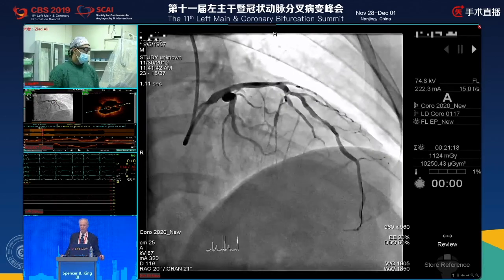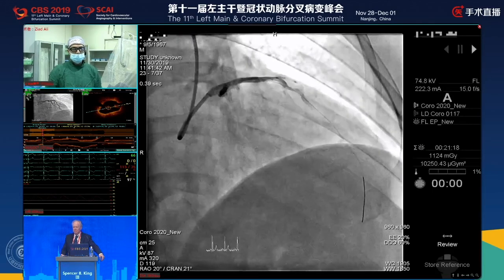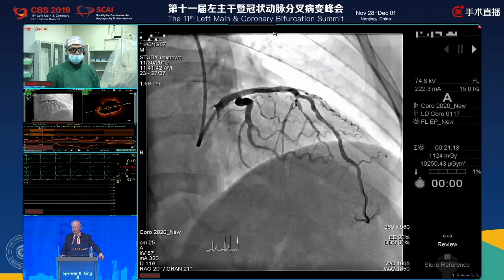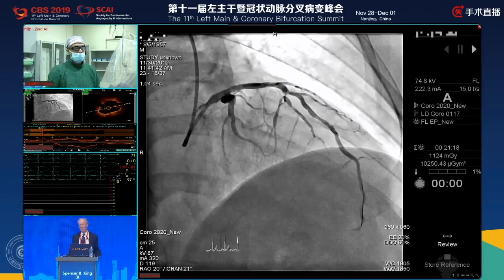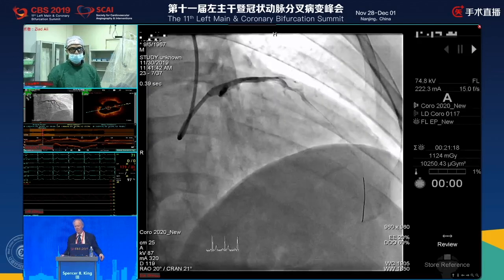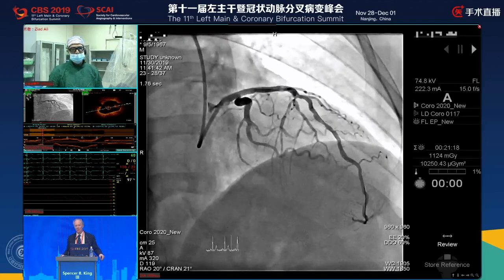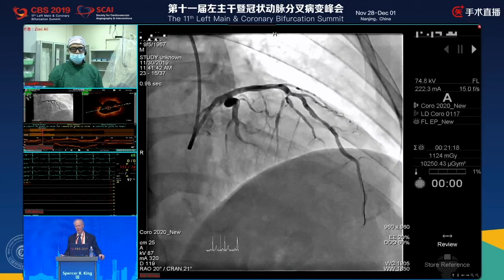But nonetheless, the patient did come to the hospital with chest pain, and the patient's on the table, and there's a 90% lesion. We took a relatively, I would say more than relatively, a very conservative approach using small balloons, less than the size of the artery, with minimal risk to the patient. So I believe we've done what we can do in terms of risk versus benefit, and it is possible that this may help the patient's symptoms.